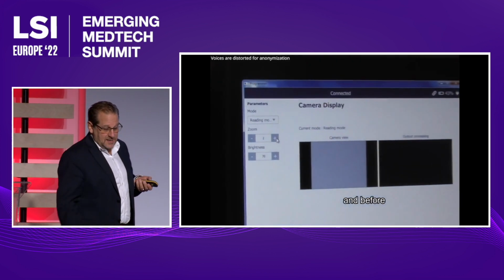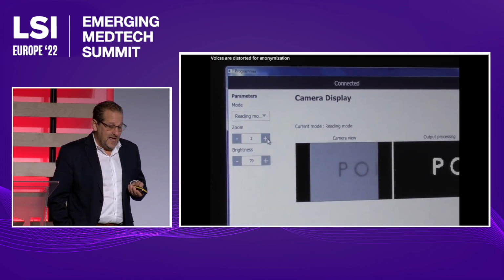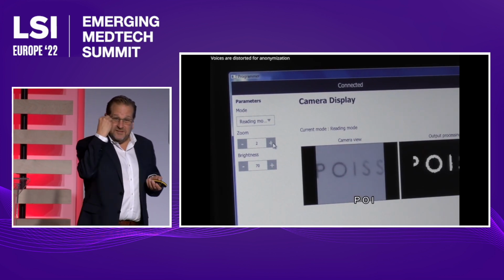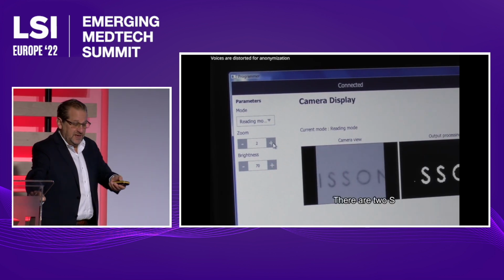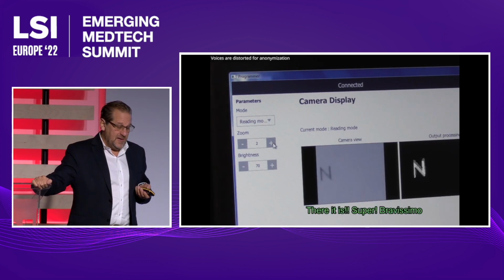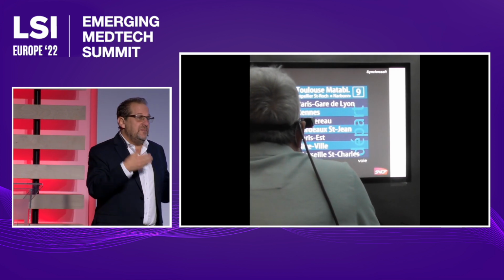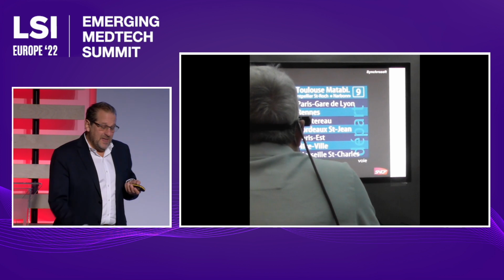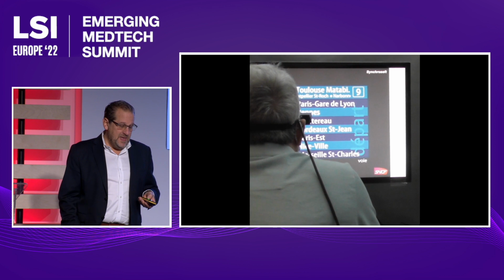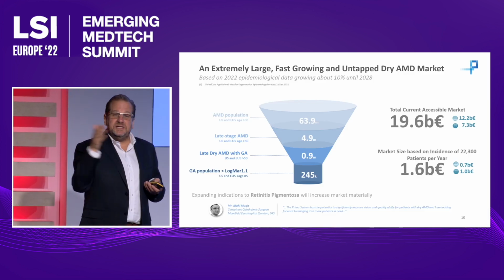And this is a display that the rehabilitation specialist has in front of them, where they actually can see what the camera is viewing and then what the implant in the back of the eye that we pose is actually receiving. And you can see that he's actually quite able to see the letters. He states each one of them, and then he states the word. And this is very typical of the patients that we've implanted and that we track post-implantation.